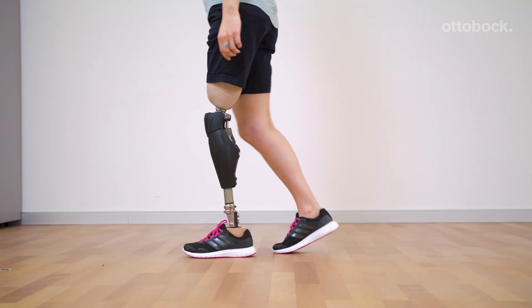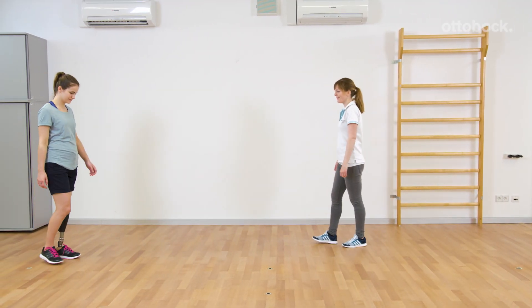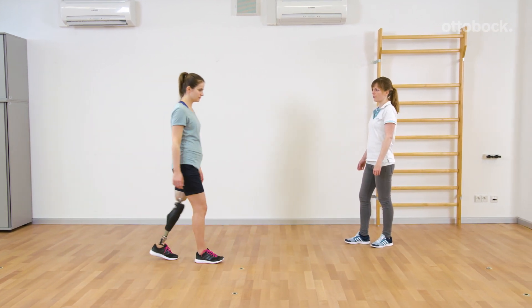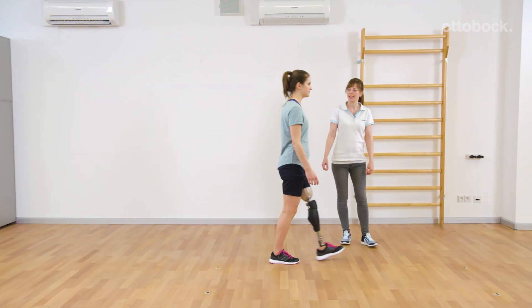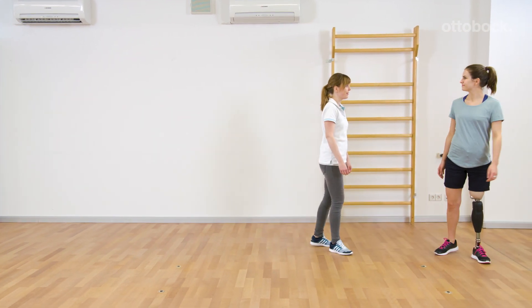Heel strike feels softer as a hard impact in knee extension is reduced. Genium guides the user nicely through the stance flexion movement via the adaptive yielding control. For automatization of this motion, regular training is recommended.